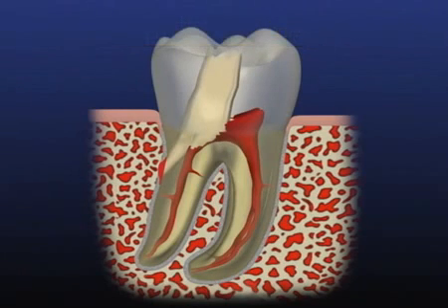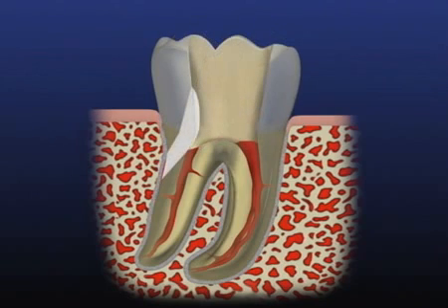Perforations create inflammatory reactions with resultant loss of attachment. Loss of attachment leads to combined endodontic periodontic lesions, which frequently escalate into additional procedures and a lowered prognosis. In general, repair the perforation during the appointment it occurs to discourage loss of attachment and sulcular breakdown, as chronic perforations with attendant bone loss pose greater treatment challenges. Now that we've seen examples of the 4 dimensions of perforations, let's look at the tools we'll need to manage these defects.